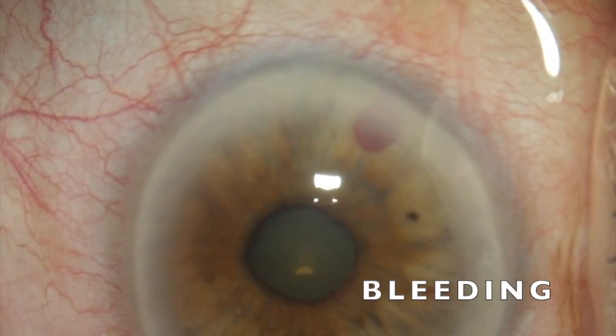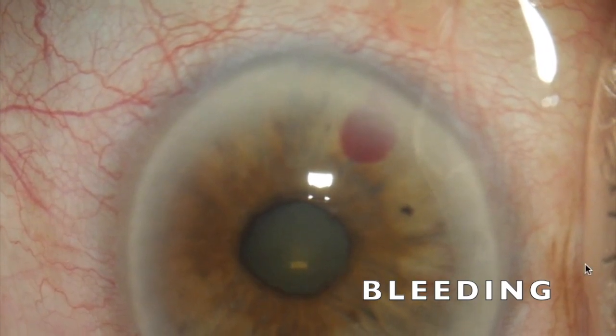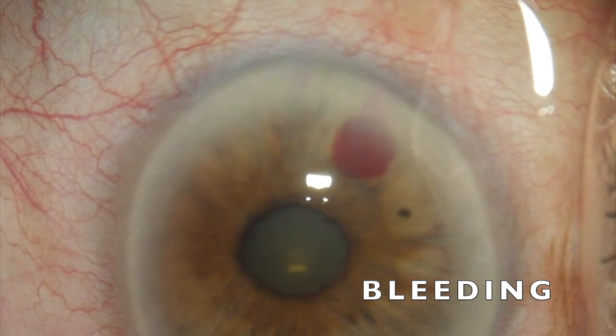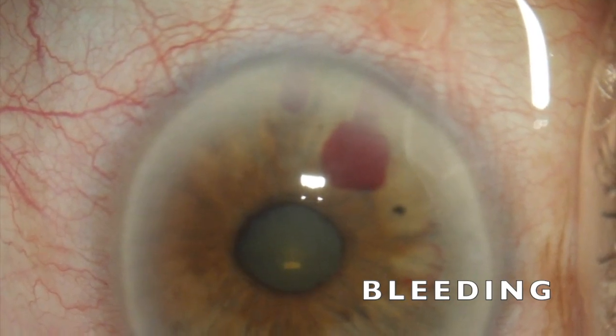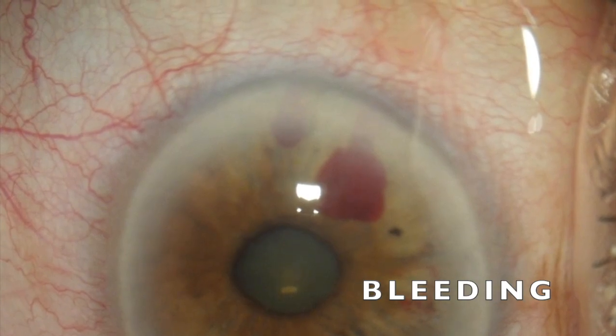What are the potential risks that you need to be aware of? The common concern that this procedure shares with any other angle procedure is that of bleeding, prolonged inflammation, and scarring of the angle. Bleeding is expected during the procedure during deroofing of the Schlemm's canal with resultant blood reflux that occurs in the anterior chamber. Post-operatively, it is common to have mild hyphema, and typically it clears with time. There is rarely a need to clear the hyphema surgically.